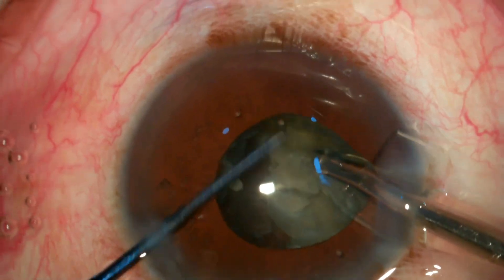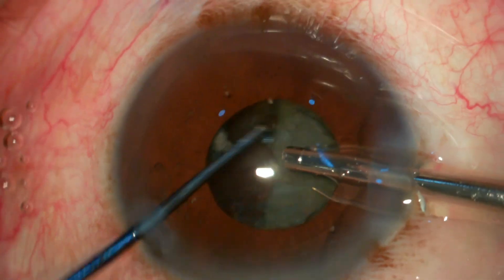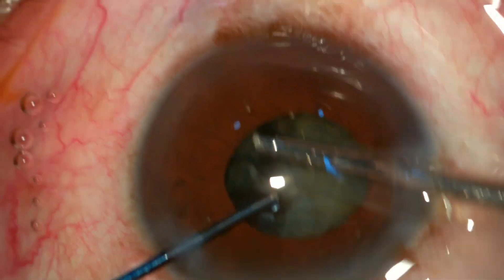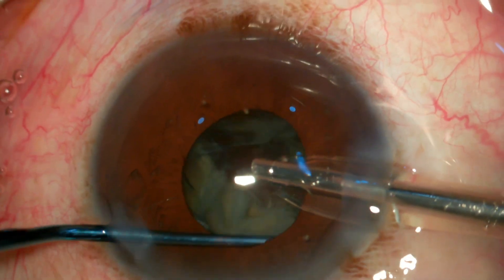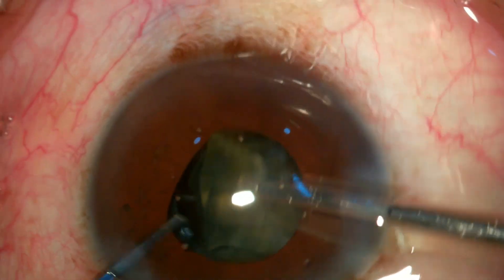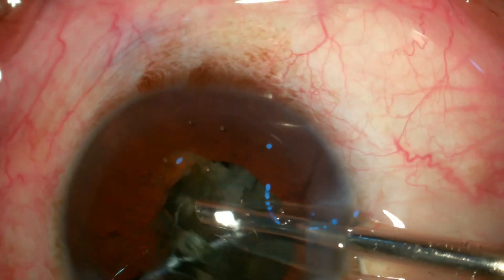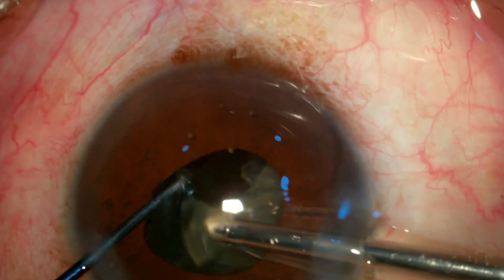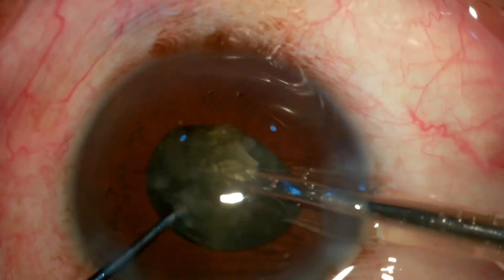What I am trying to follow in these patients is doing all the maneuvers in the central safe zone of 5 millimeters without going to the periphery. As you can see, this is an unedited video of phacoemulsification, and if done in the right direction, we can do phacoemulsification in these patients without even touching the iris or trapping the iris into the phaco probe.